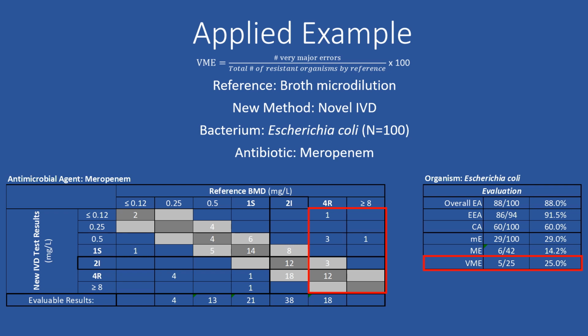And I want to revisit major errors for a moment because I just remembered this. If this were a true diagnostic device I was looking at, and I was getting these high major error rates, I'd look at the degradation of the antibiotic, which can be accomplished analytically using an HPLC or alternative instruments. Or, to be more cost effective, you can run quality control using ATCC organisms, and the protocol for this is discussed in detail in the CLSI documents.